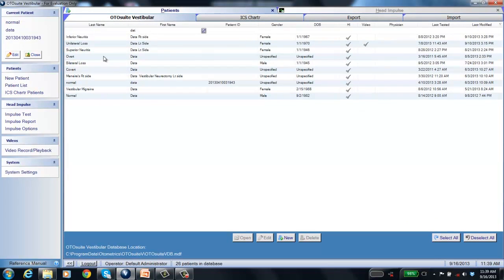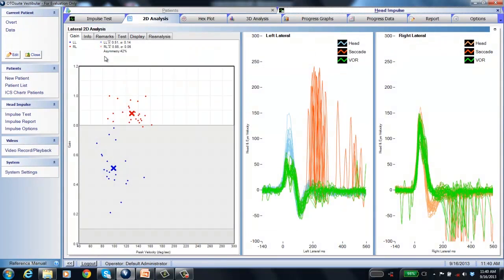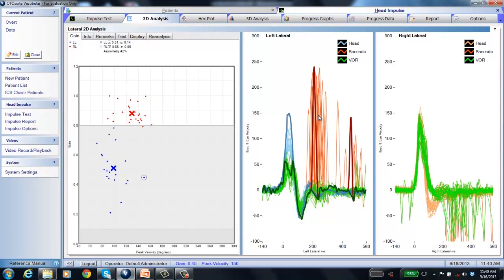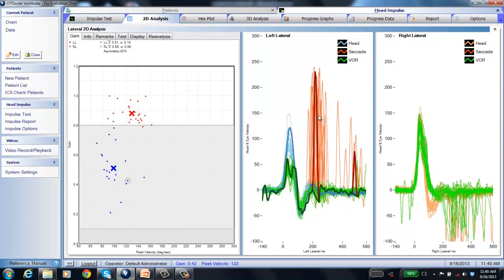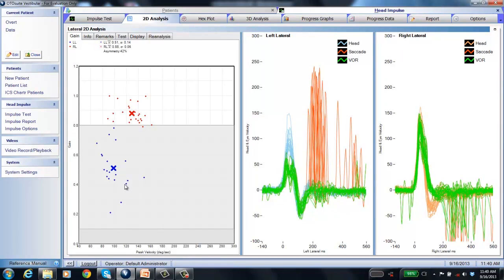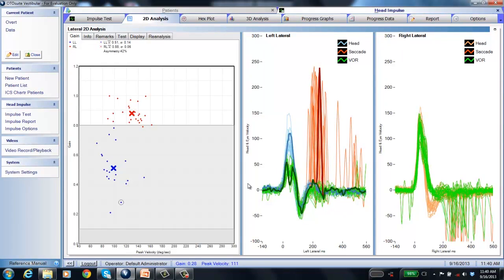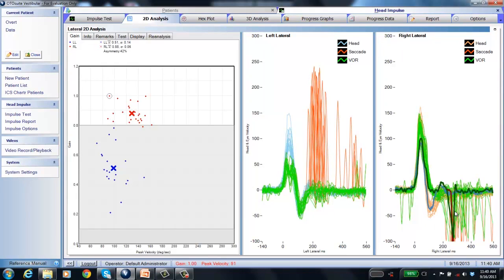Now looking at abnormal data, starting with the overt catch-up saccade patient. The overt and covert data were collected before LARP and RALP were available. In version 2.0, beautiful red spikes show the overt catch-up saccades. Using up/down arrows to scroll through each impulse: blue is the head, green is the VOR, red is the spike, and the circled point in the gain graph shows the gain for that one trace. You can clearly see catch-up saccades happening after the head stops — those are overt. On the right side, the downward spikes are spontaneous nystagmus, but the right side is normal.